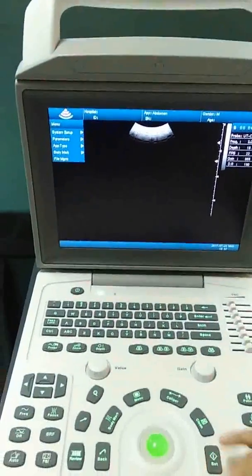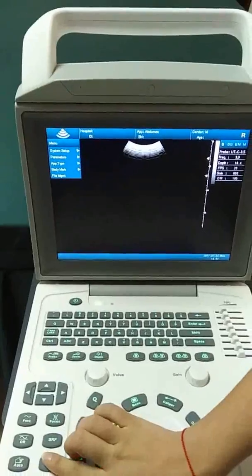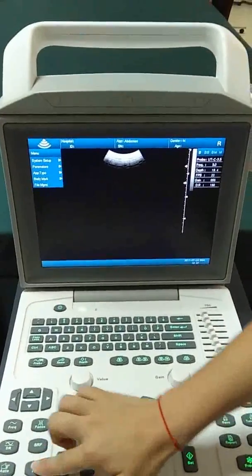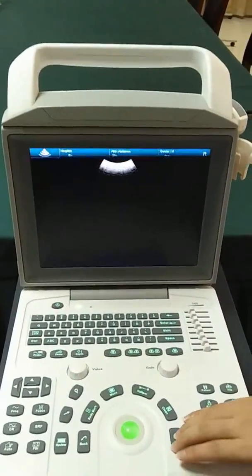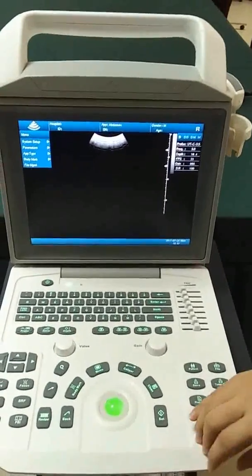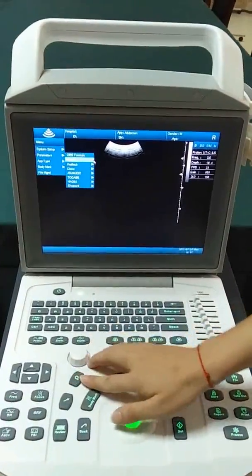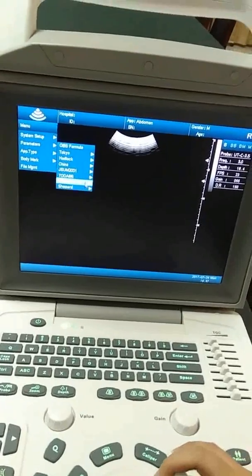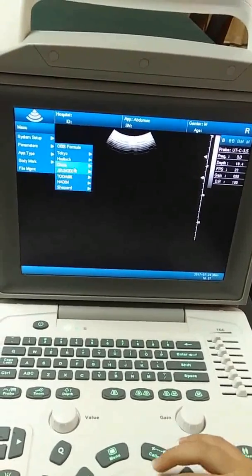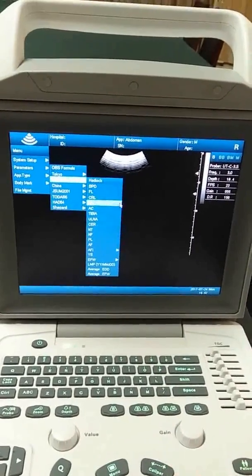Next is the one-key full screen image function — very convenient. Then we come to the very important Q key, which is also very convenient as it covers all OBS formula functions. Then we do the caliper measurement.